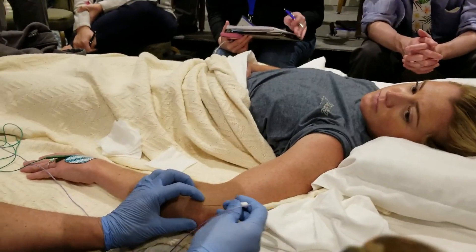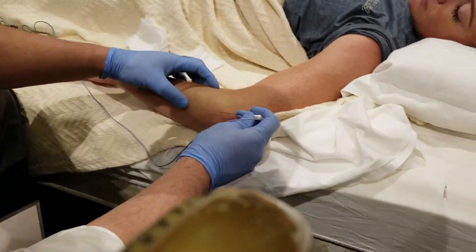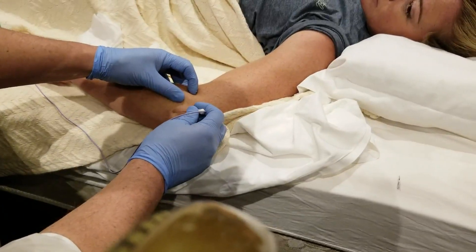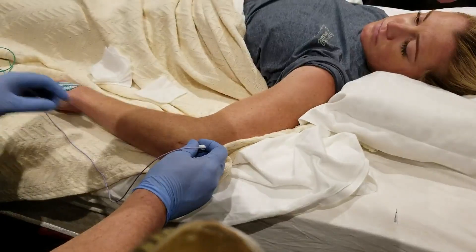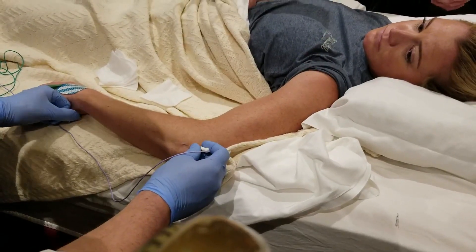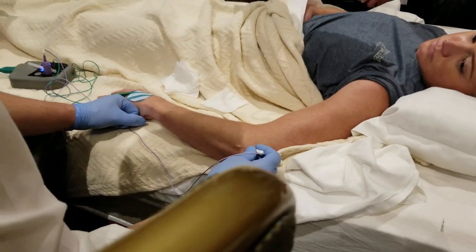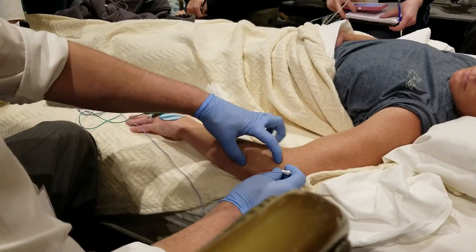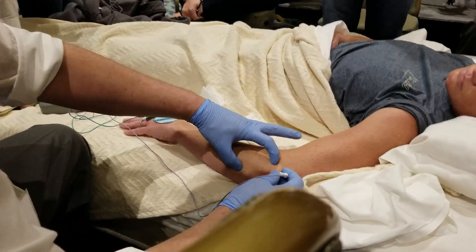I'm going to find my landmarks halfway down, halfway through that line, and angle right to here. There's a relatively stiff or tough retinaculum overlying the muscle right there, and I'm in the muscle right there. You can see the landmarks here — these are the three points of the triangle right there, and you're just up from the base of the triangle.